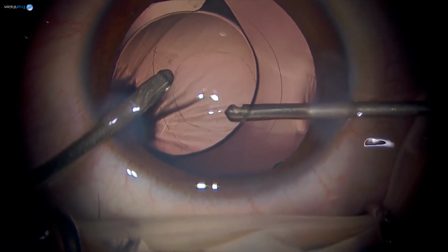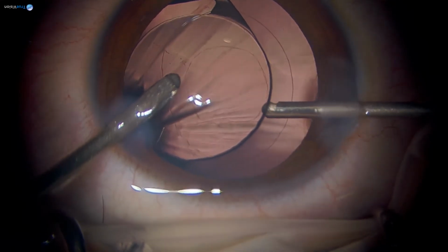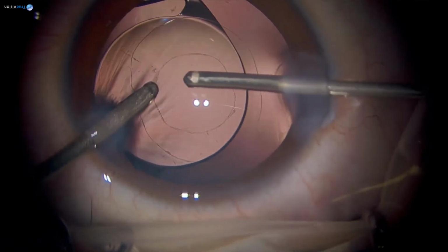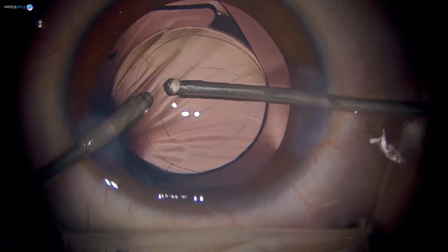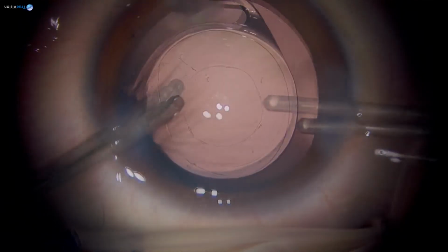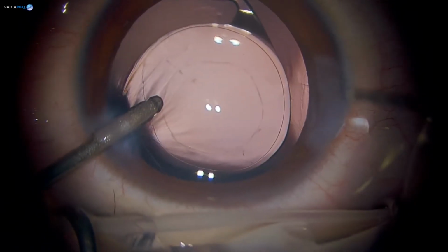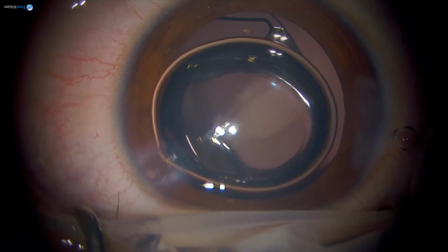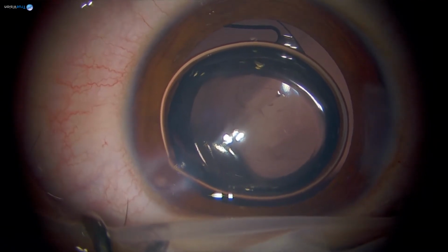So when you come out, check the centration of this lens. This is the last time you're in the anterior chamber. When I come out, what I do is I inject air with the other hand, and then I suture. Again, if you put viscoelastic at this point of time, it will disturb things and you have to go in again. So that is one step less.